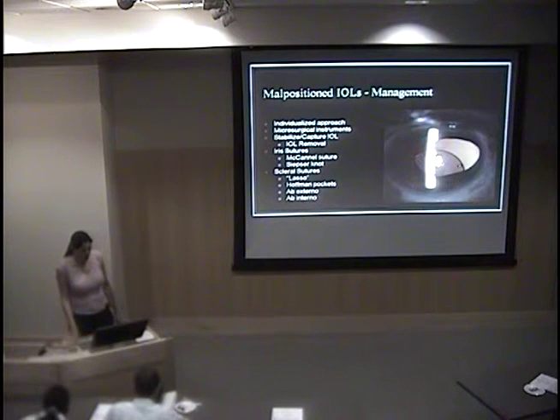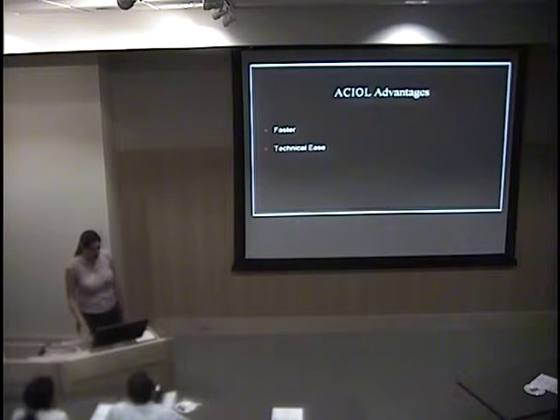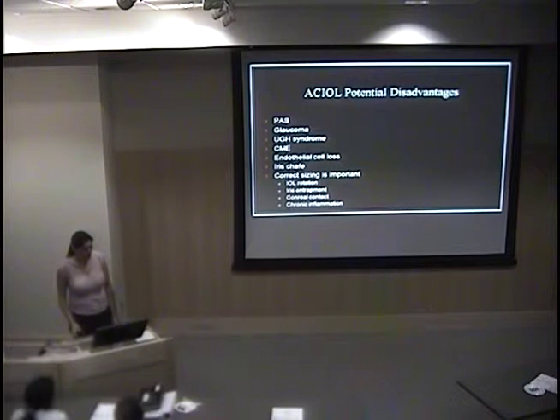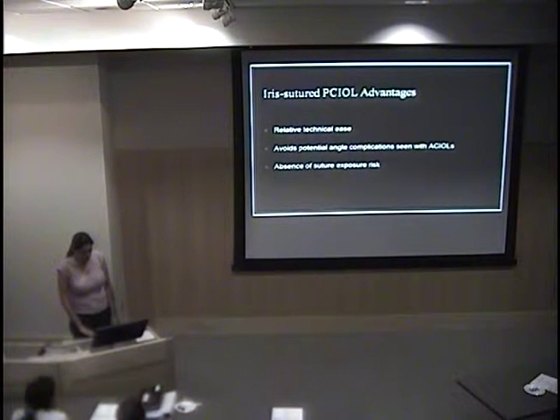There are several different ways to manage dislocated lenses. Certainly you can put in an ACIOL, you can suture a lens to the iris or sclera, depending on what's already in the eye. ACIOLs aren't a bad option. Everyone knows how to put them in, and they're fairly quick. They do have several disadvantages, of course: glaucoma, CME, corneal decompensation. The sizing of the IOL is important to prevent IOL rotation, which can lead to chronic inflammation and iris entrapment.